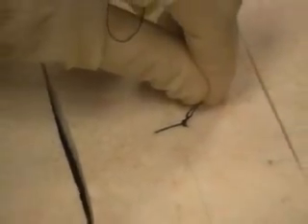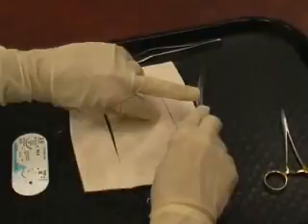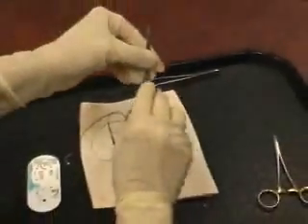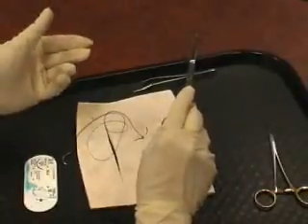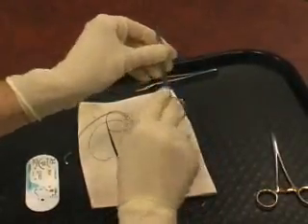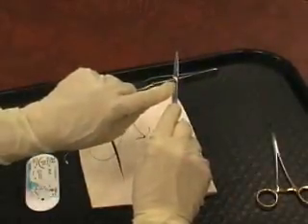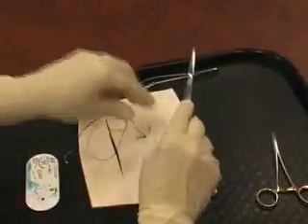We're ready for the cutting technique. And what you want to do is, again, hold the scissors as if it's the tripod grip that we talked about before. There's actually a little screw here on the scissor. That means the scissors should be in this position rather than this position. It's just the way the scissors are manufactured to cut. It's not a big deal in the ER setting, but in the OR setting, it's just good technique to always pick up the instruments in this position. If you see that little screw, that's meant to be up.